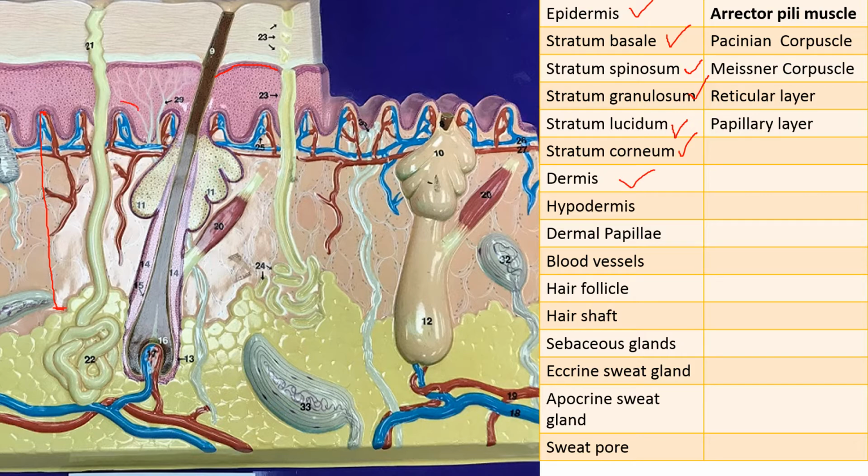The hills that you see here that poke into the epidermis, these are the dermal papillae, and as you can see, they feature capillary loops here. The red capillary loop is connected to the arteries of the body. They are bringing blood from the lungs to the tissues, where the oxygen from the blood will diffuse into the tissues, and then carbon dioxide from the tissues diffuses into the blood.